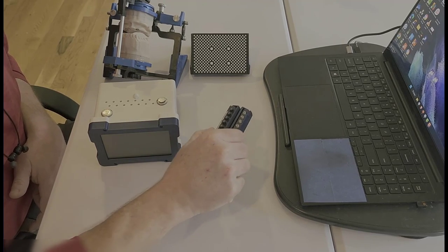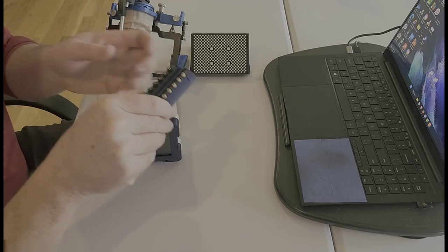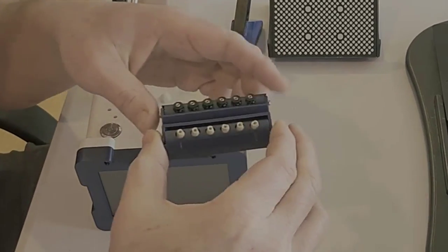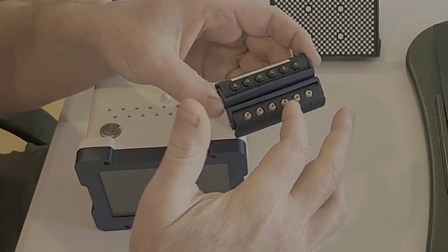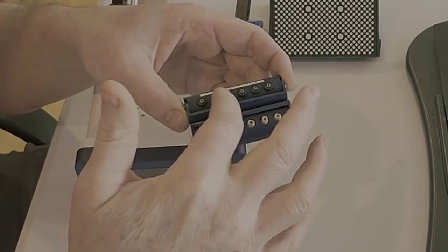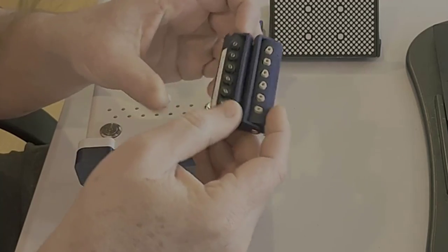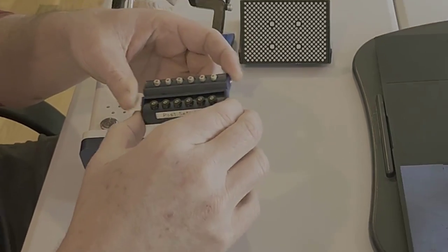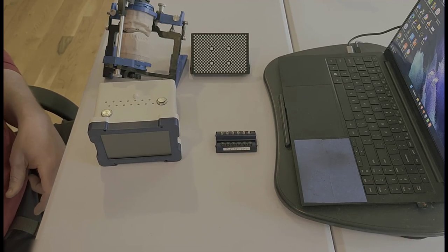Okay, so we just captured our intraoral scan, and we did that with the intraoral scan bodies. These are the scan bodies in the little holder that they come in. These are your scan bodies for intraoral scanning. These are the scan bodies for photogrammetry. And do notice that each set has a specific number. That's important that you match those up in the software.